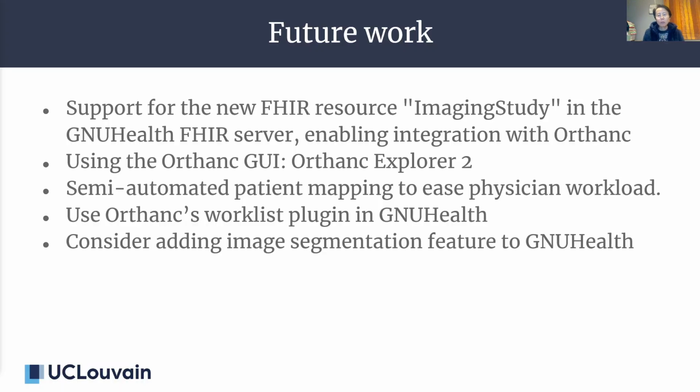Add a semi-automatic patient mapping to reduce physicians' workload. The Orthanc Worklist plugin can be used within GNU Health. I can add an image segmentation feature to GNU Health.